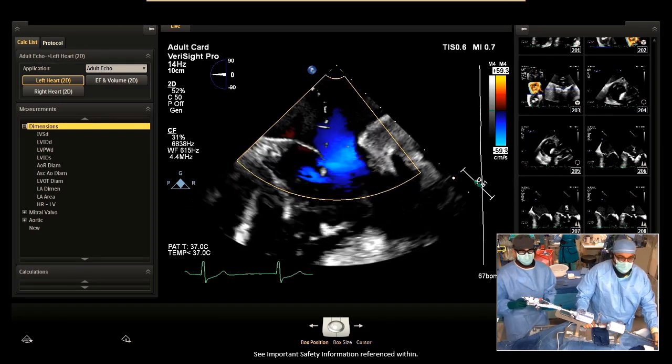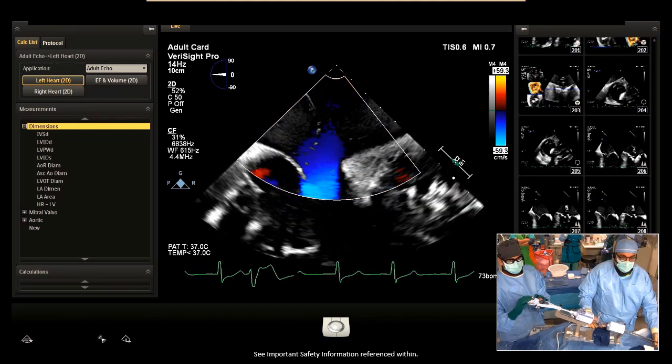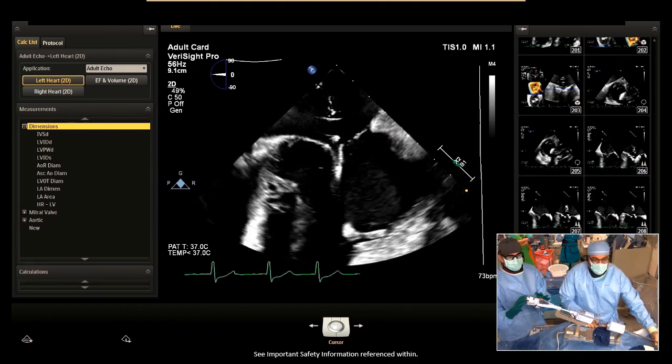He said, oh, wow. And so now what we're going to do is this. I'm going to try to centralize this thing first. There, I've centralized the valve, the arms there. So now just go ahead and give me an X-plane there.